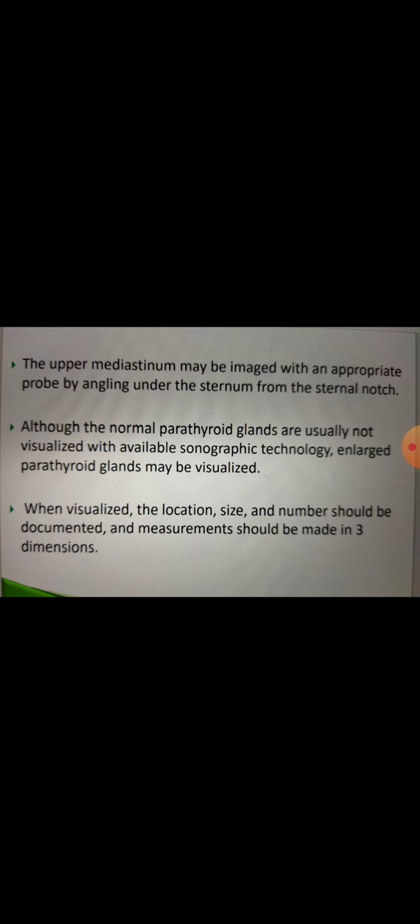As I have stated earlier, it is usually not possible for us to visualize the parathyroid glands on sonography. To visualize them, you basically need a very high frequency probe that is not applicable clinically. So with available sonographic technology, you cannot usually see the normal parathyroid gland.